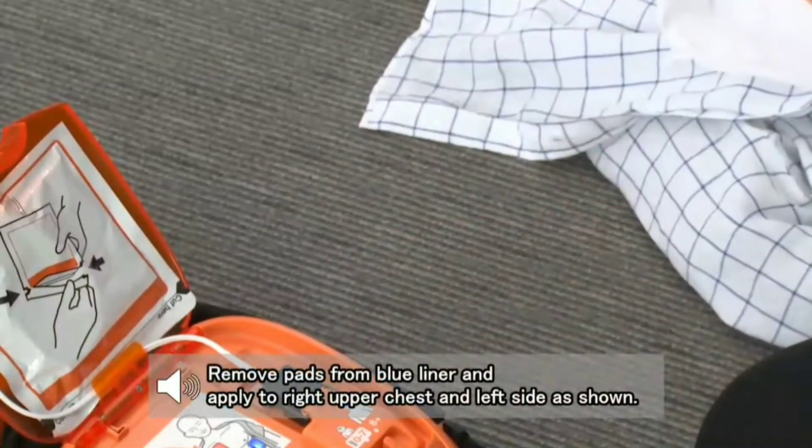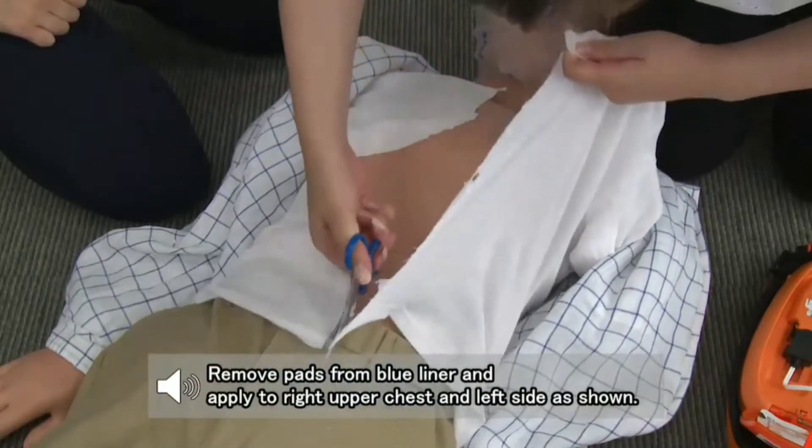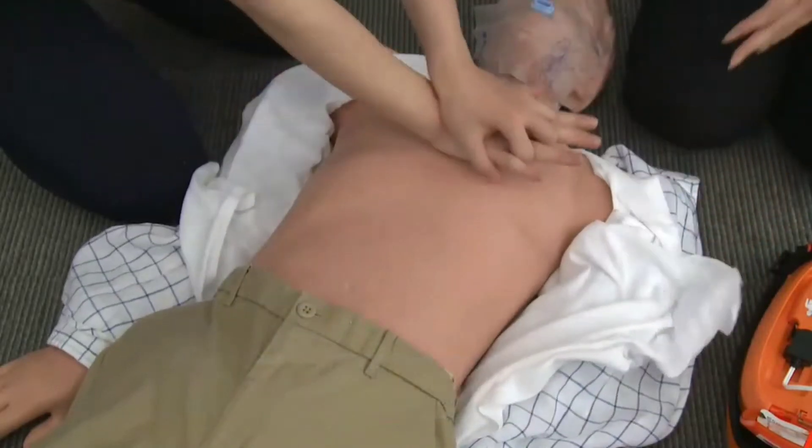Remove pads from the blue liner and apply to the right upper chest and left side as shown. Remove clothing from the chest. If clothing is difficult to remove, cut through it with scissors.